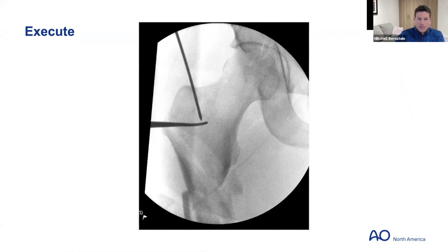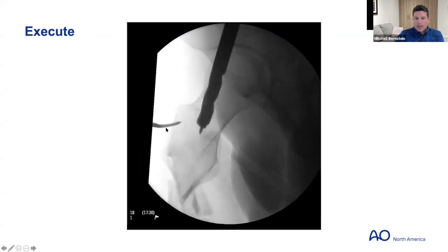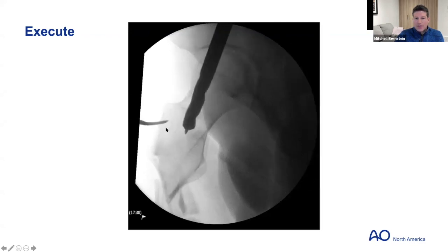I'm using just medial to the tip of the trochanter. And I'm using, again, a bone hook to help with the sagittal alignment. Now here, what's important is I'm not happy yet. I have the good entry point, but I'm clearly aiming posterior. So I'm pulling down with my left hand on the shoulder hook, and then I'm going full speed and adjusting the reamer without advancing so I can get a good trajectory on the lateral. But I am very nervous at this point.